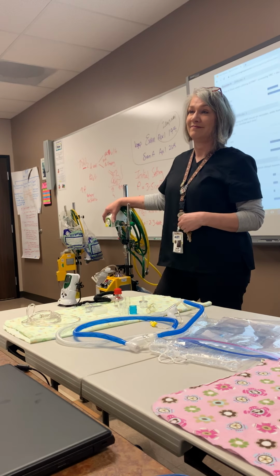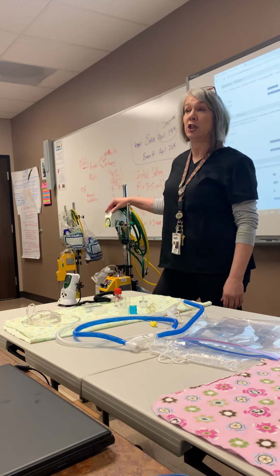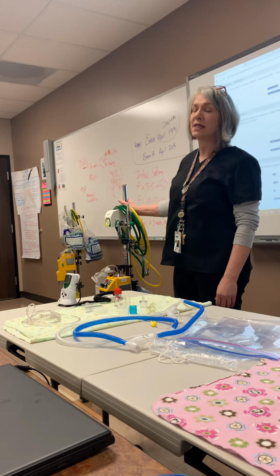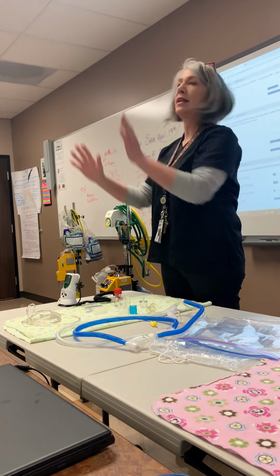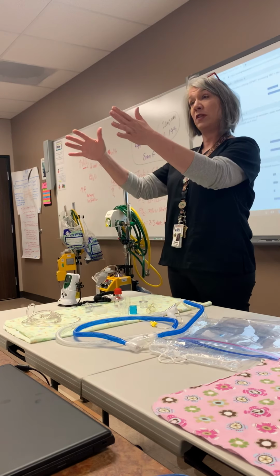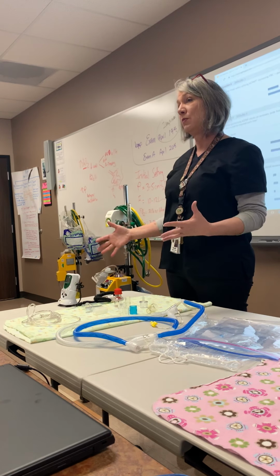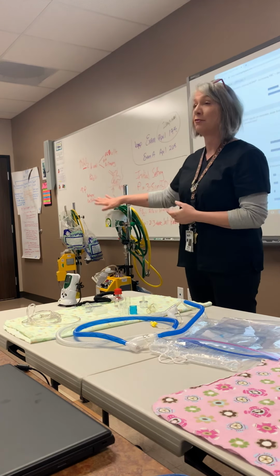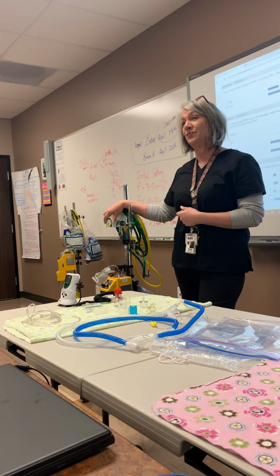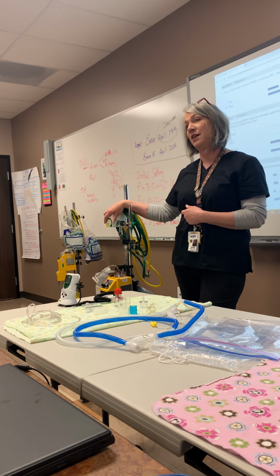No, I understand that. So it's that 1 for 1? I understand that. You're talking about the pressure? Yeah. So the pressure, because that baby was on 8 liters of high flow. So this is not nasal cannula. This is high flow with pressure, 8 liters. You just needed to think they needed a little bit more. And really there was only one question that had the correct FiO2. So it was really not about the pressure. It was about, could you identify the FiO2?